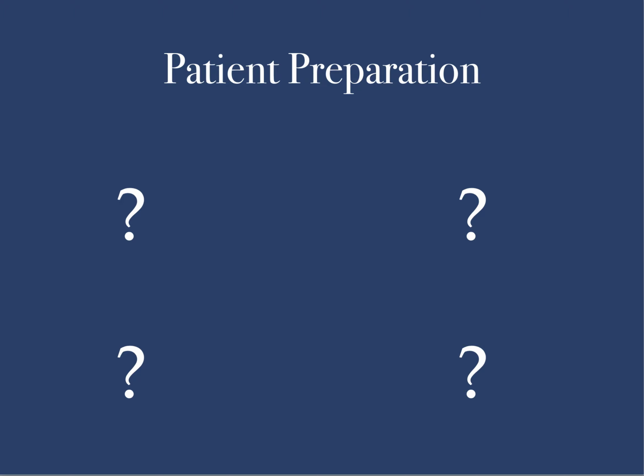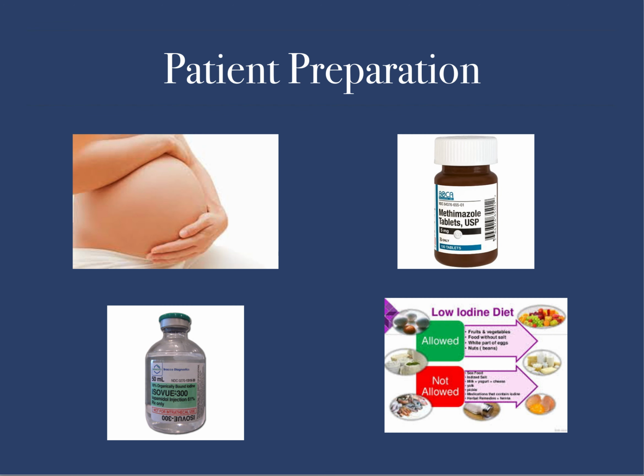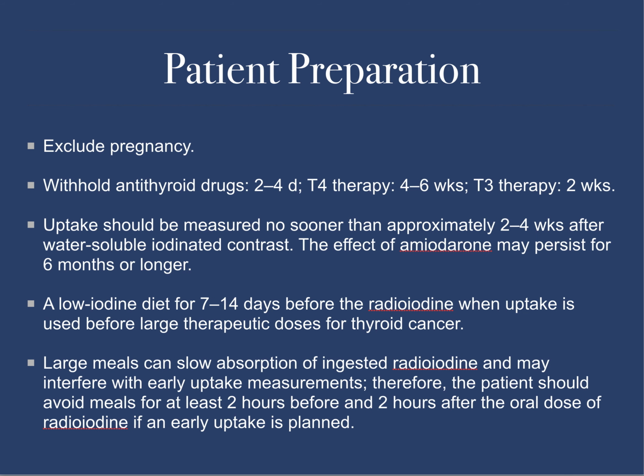All right, so in nuclear medicine, we always have to deal with patient preparation, and when it comes to thyroid imaging, we have to deal with issues of pregnancy, iodinated IV contrast, anti-thyroid medication, so methimazole and PTU, and the questions of low iodine diet. Actually, that low iodine diet is pretty painful. Wouldn't recommend it for anyone.